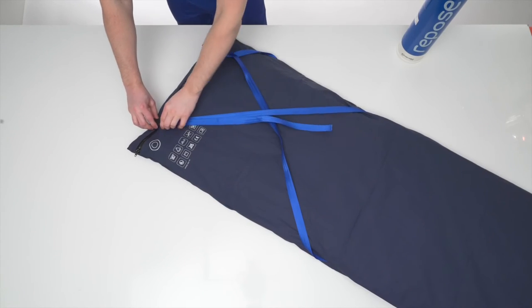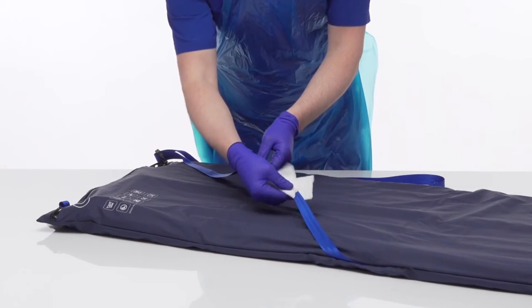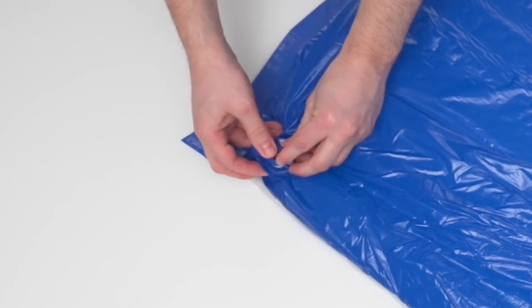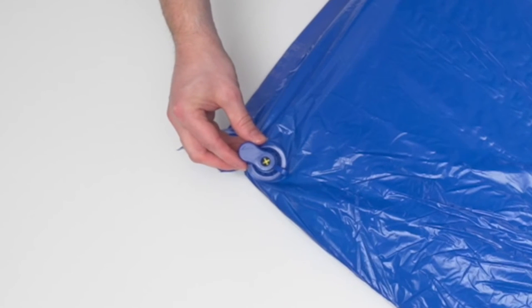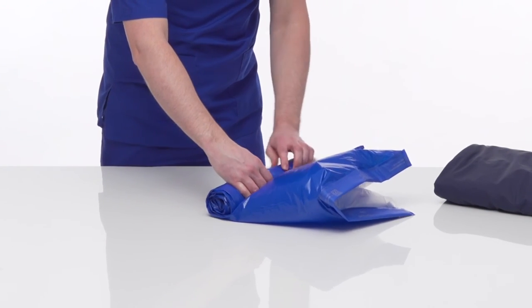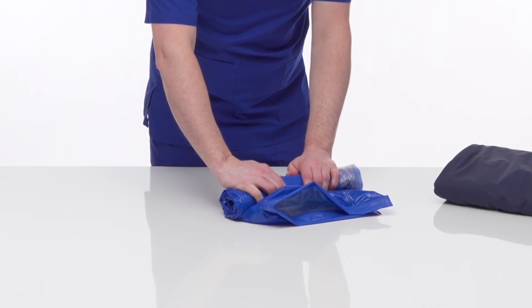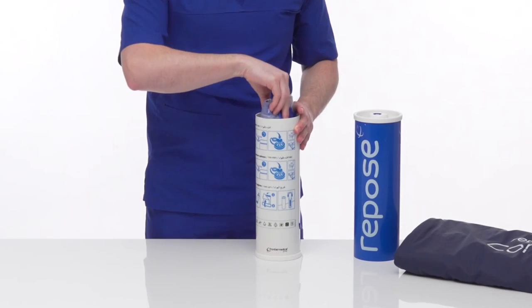With the patient off Repose, detach from the chair. Clean and decontaminate as per the instructions. Once cleaned and completely dry, remove the sealing cap from the Repose valve. Insert the open end of the sealing cap into the Repose valve, allowing air to escape. Once deflated, with the cap still in place, roll up Repose starting at the point furthest away from the valve, expelling any remaining air. Repeat this process as necessary. Fold and roll up and place inside the pump for safe storage. Rotate the outer tube until it clicks closed.